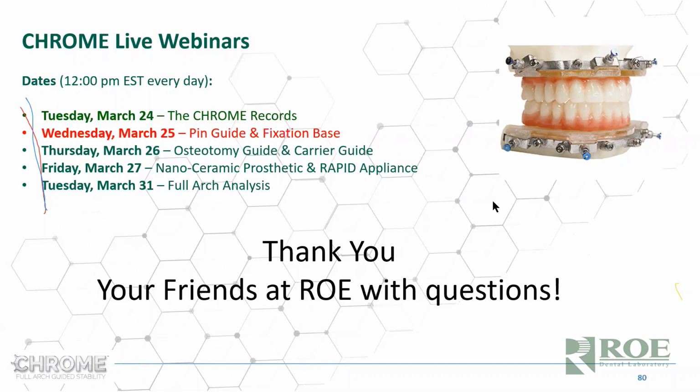So the mousse is impressed over the soft reline material. Do not remove the soft reline. Exactly. That's the point of it, that the soft reline can stay in and just do a wash. You want the green or blue mousse to be kind of everywhere, not to be washed out. So use a fair amount of it, so you can see green or blue pretty much everywhere, and that is now your scan appliance. Yes.